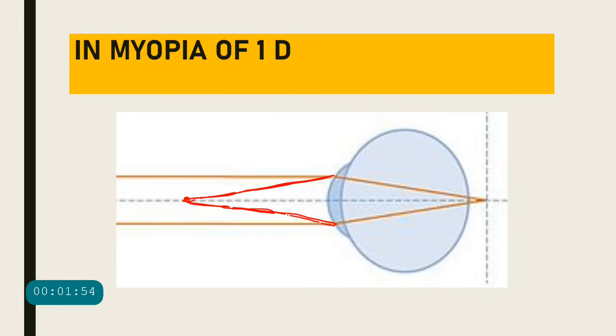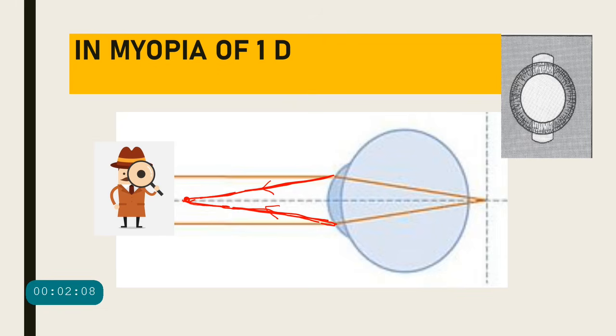Okay, the focal point is also going to be 1 meter like this. Now, what did I tell you? The doctor himself is sitting at a distance of 1 meter from the patient. Now, what is happening? All the rays are actually converging onto the doctor's pupil. So, what will happen? We will have a neutralization reflex already. So, neutralization reflex will be there without introducing any lens. So, the gross retinoscopic value will be about 0.